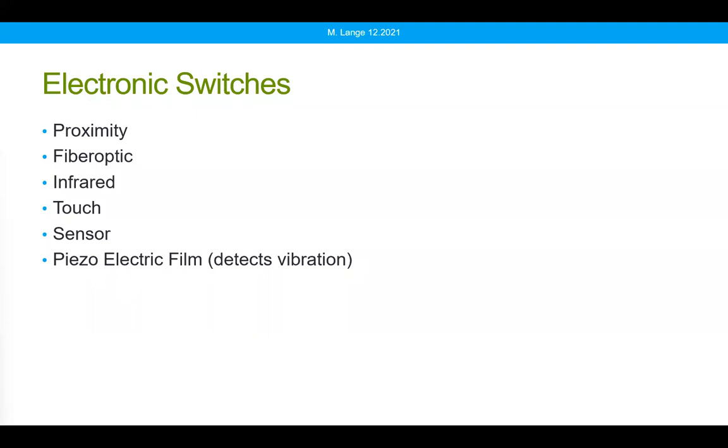Do you know if any companies allow you to trial any of their switches? We have some lending libraries in our area. They don't always have all the options. You might need to trial. Switches can be costly, etc. So agreed. Some manufacturers do allow you to borrow switches to see if they work for a client.